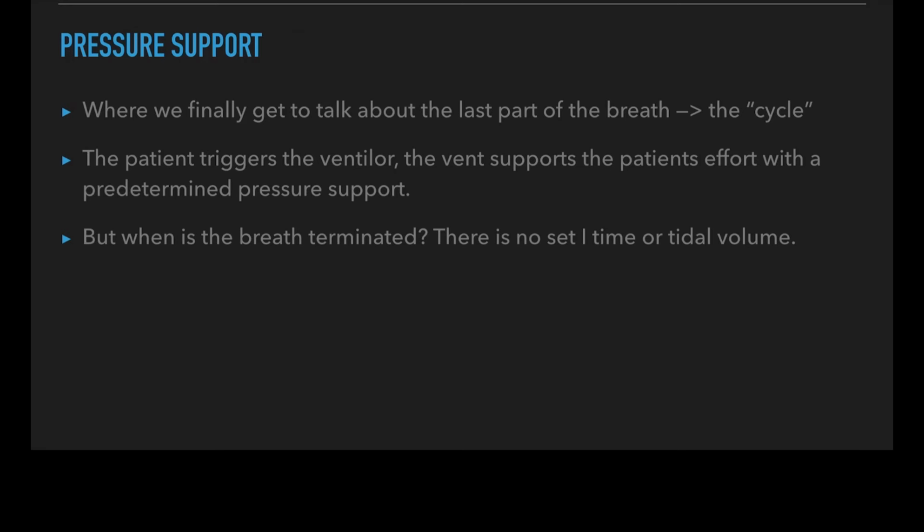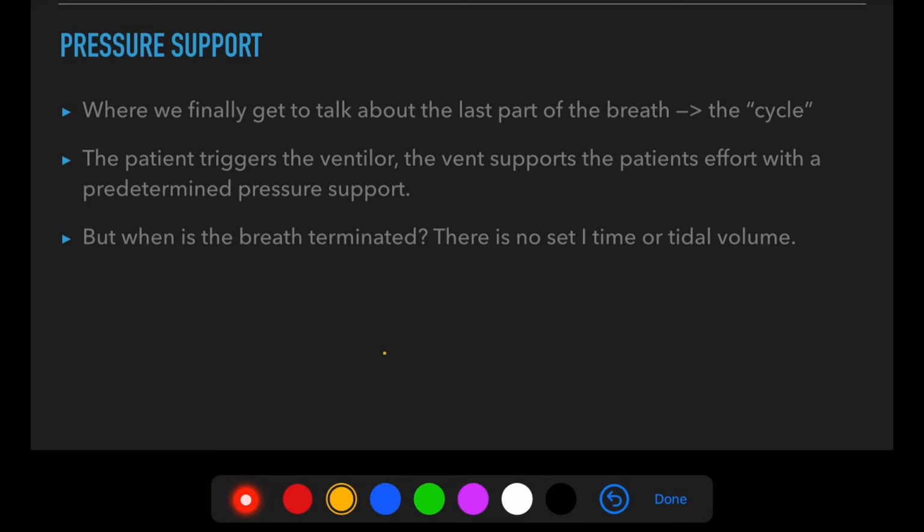Pressure support. This is where we are finally going to talk about the last part of the breath, the cycle. So let's go back. We talked about the trigger already. The limit, trigger, limit, and then the cycle. When do we want to cycle from the inhalation phase to the exhalation phase?